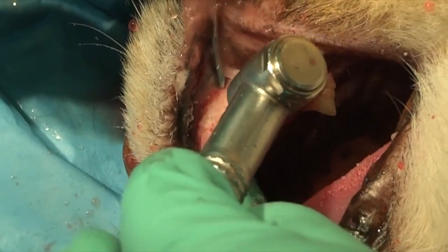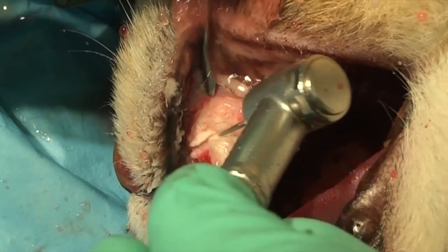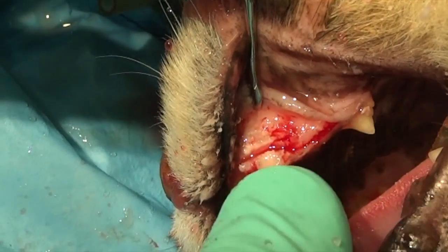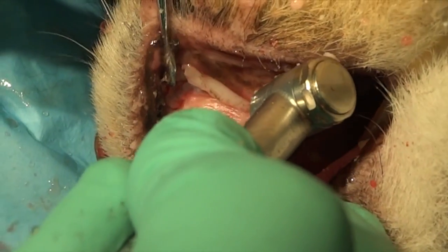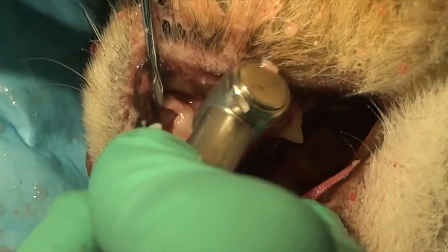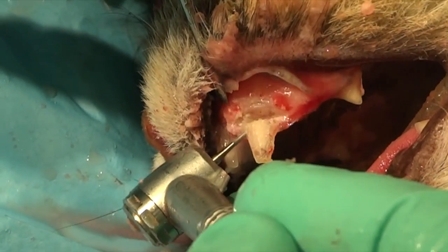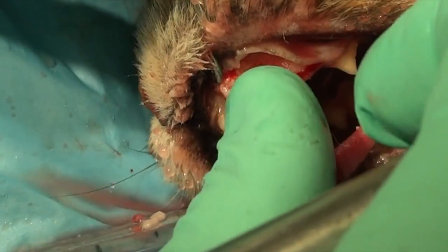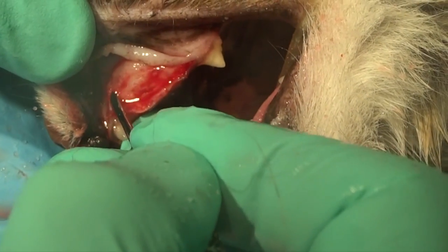So here we are just making an incision into the bone with the cross-cut at that area where there is nothing but bone. The tooth is gone. We can visually see that the interface is coronal to where we're cutting. Now we're going to test that to see if we can dislodge that section of the crown. We still need to do a little work here, so we'll go back and take a little bit more bone away until we can digitally place our pressure and just snap that off without having to get deeper into the tissue to possibly damage that palatal mucosa.